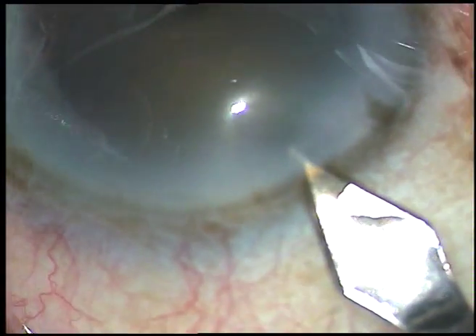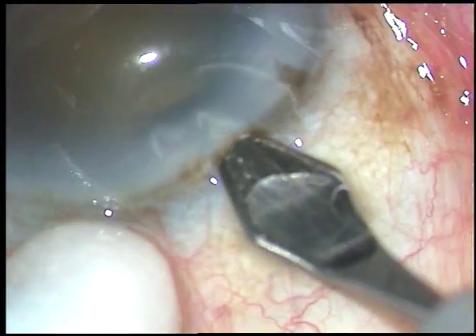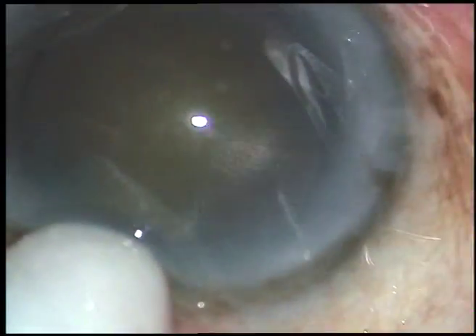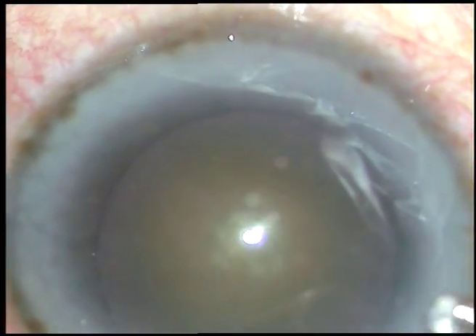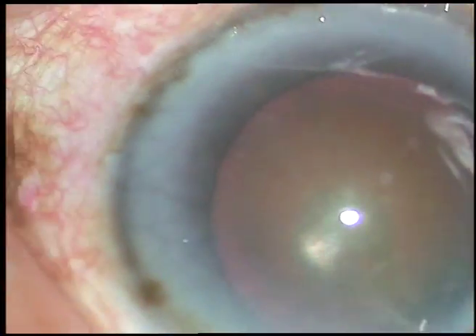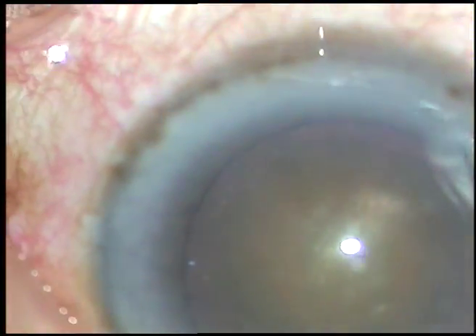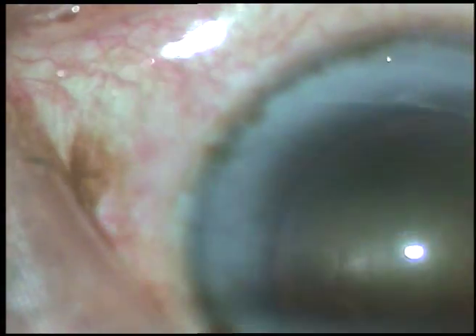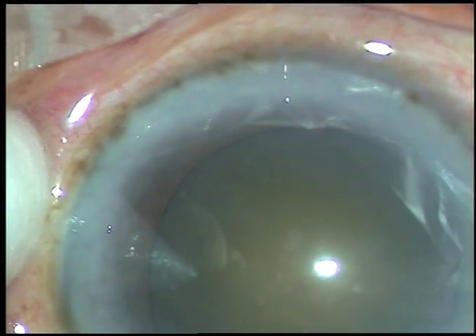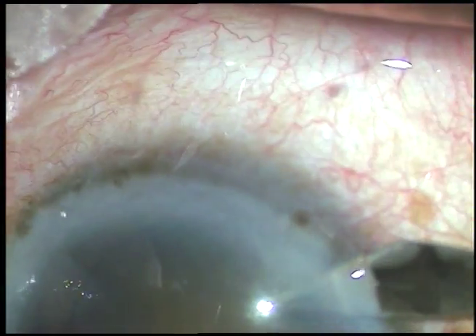This is a routine cataract surgery. This is the main incision — a 2.8 millimeter incision. Now viscoelastic substance is injected into the anterior chamber. The patient is under topical anesthesia.